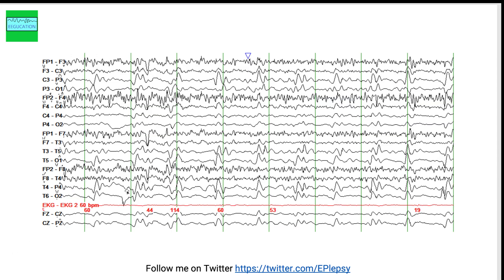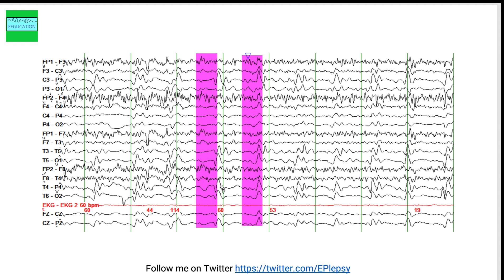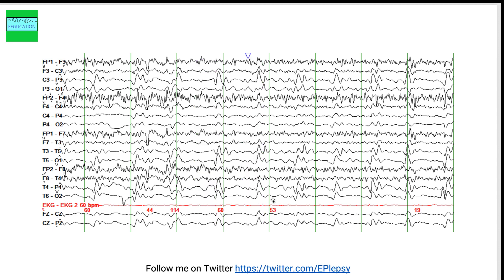This patient had a rapidly progressive dementia. You see periodic discharges at a rate of one per second. This is a finding that can be seen in patients with CJD — Creutzfeldt-Jakob disease — which is a form of rapidly progressive dementia. This is a pattern you need to recognize for your exams.